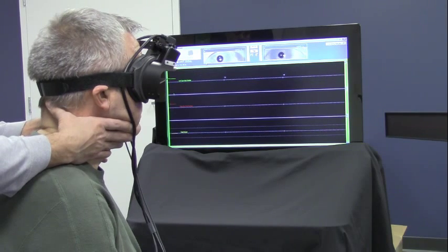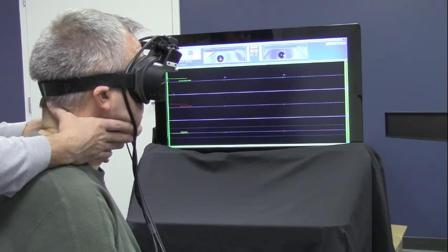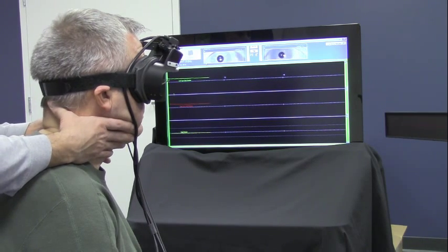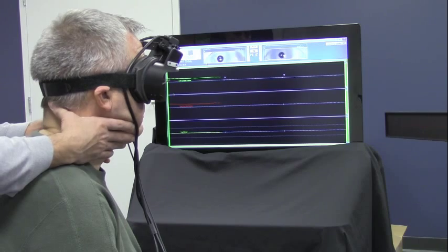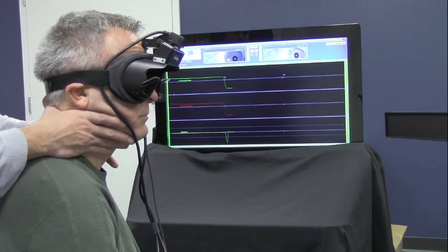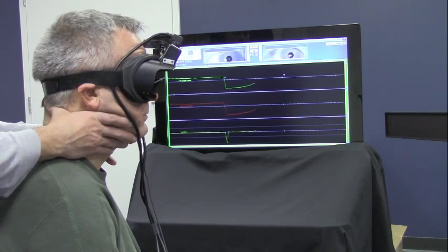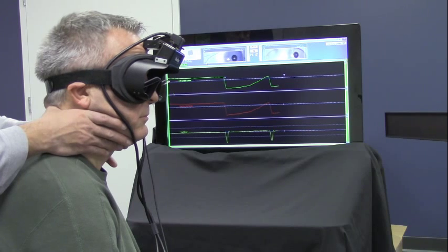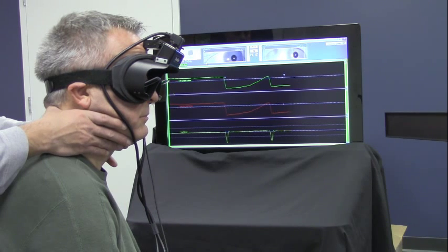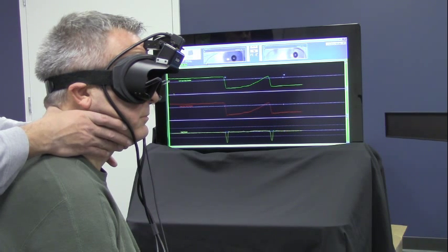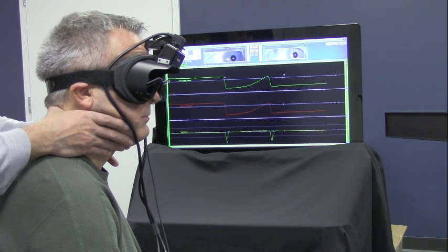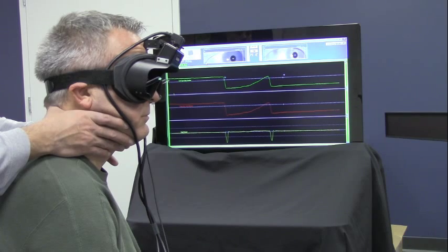There is a counter on the top left corner of the screen which tells you how many thrusts you have had to the left or the right. That indicator will turn green when the minimum required thrusts have been completed.